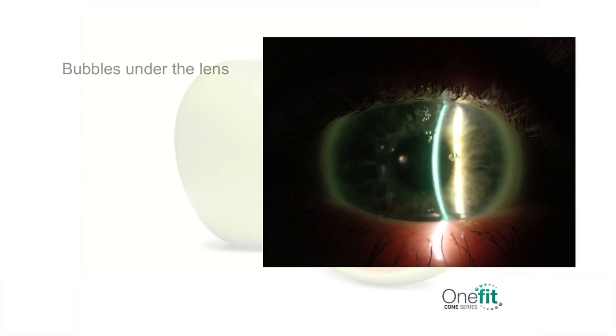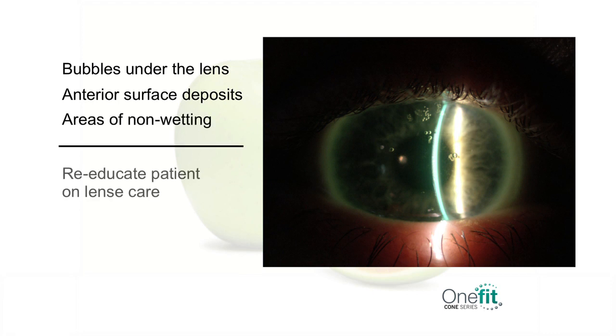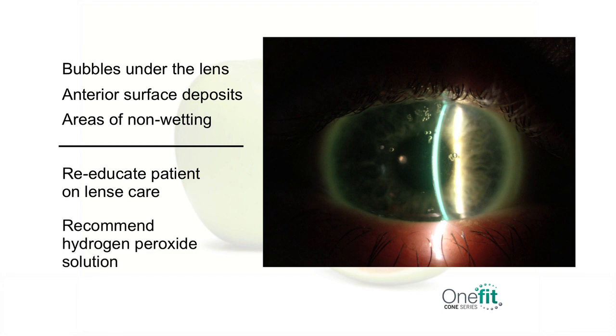If vision is insufficient, make sure that there are no bubbles under the lens and check for anterior surface deposits in areas of non-wetting. If any of these are found, re-educate the patient on lens care or consider recommending hydrogen peroxide solution. If none of these causes are present, then perform a spherocylindrical over-refraction to identify any residual astigmatism.